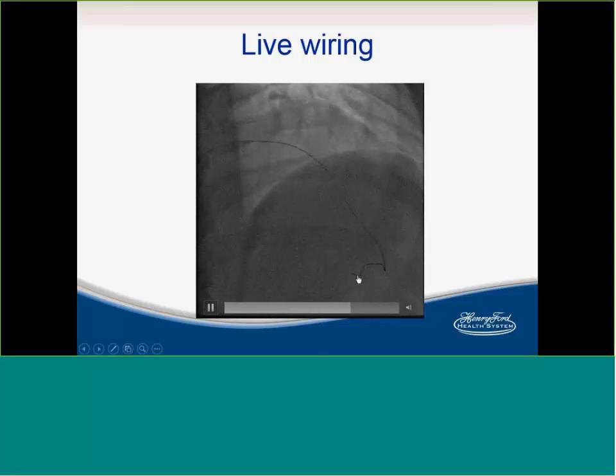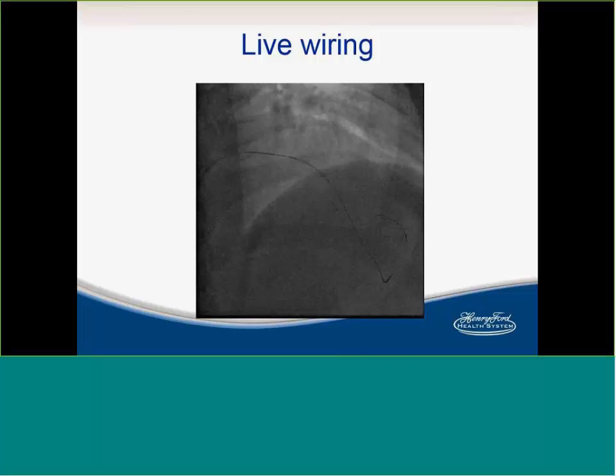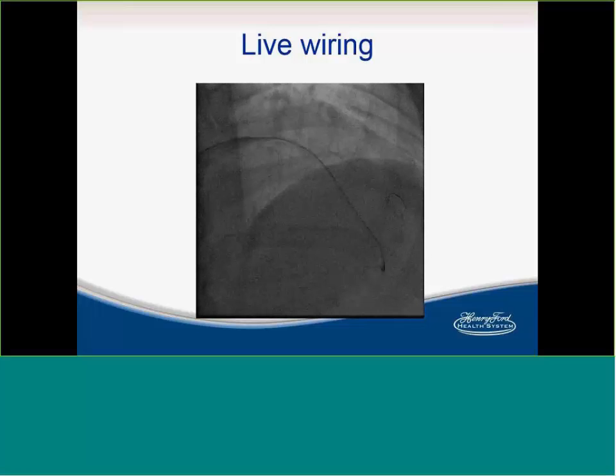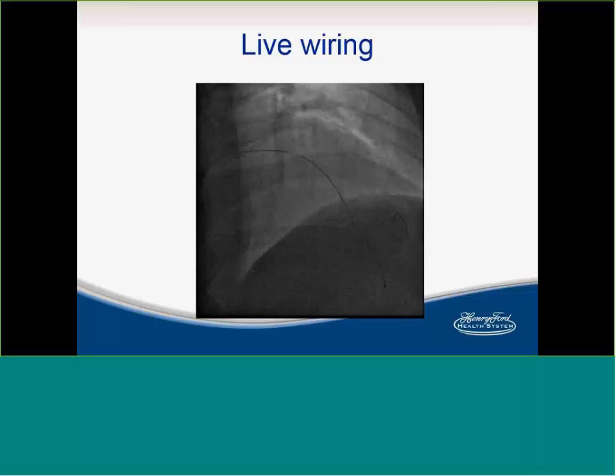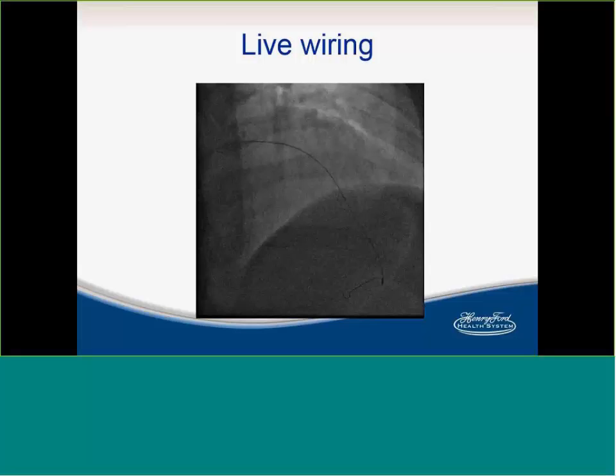I watch here, and this is some tortuosity, and watch how the wire straightened the tortuosity. So if I can say, some of you may not be as experienced. Again, this is not something you do when you're starting CTOs. You must do whatever 50 or 100 retrogrades to the septals before you do this, right? Absolutely. This is not for beginning operators. And it looks to me like almost you are surfing the collateral, but you know exactly the course. That was the other thing. People may think you're just surfing the epicardials. You don't normally do this. You just know where you're going.